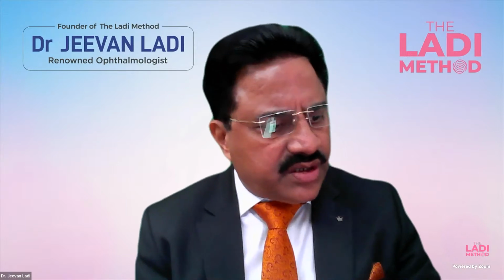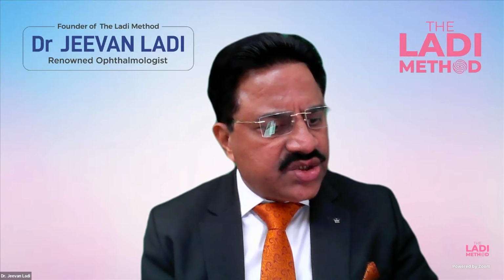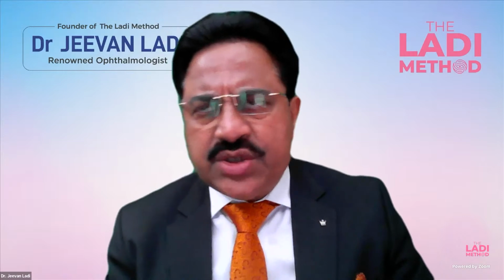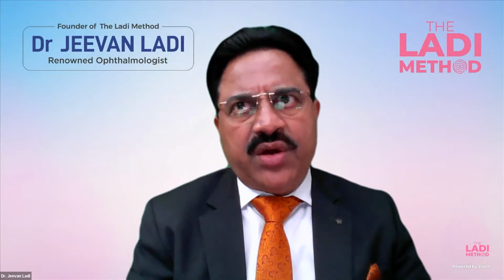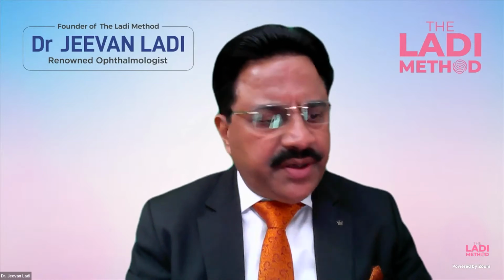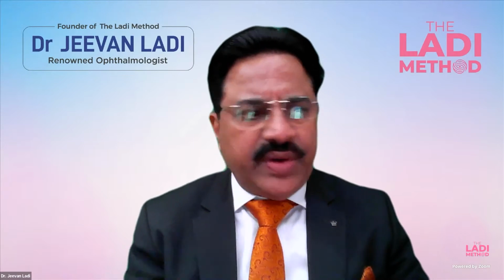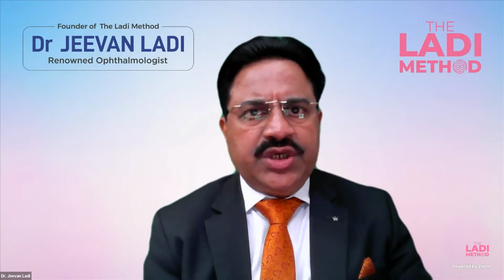There's another question from Dr. Kaushik Shah from Maharashtra. When planning for toric IOL, which K readings do you choose? Manual K, auto K, IOLMaster or Pentacam? It's a personal choice. All machines are doing good. What we do, we take readings from topography at 3 millimeter, and we compare it with automated keratometry. Both are comparable, so it's your choice, whichever gives you a good reading.